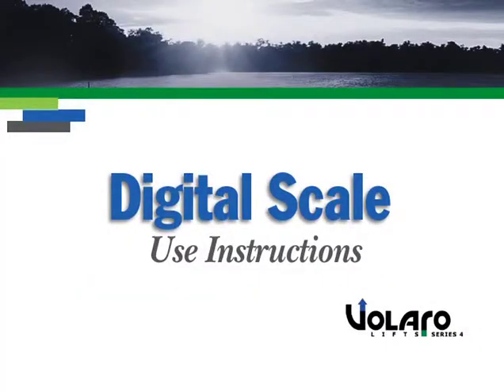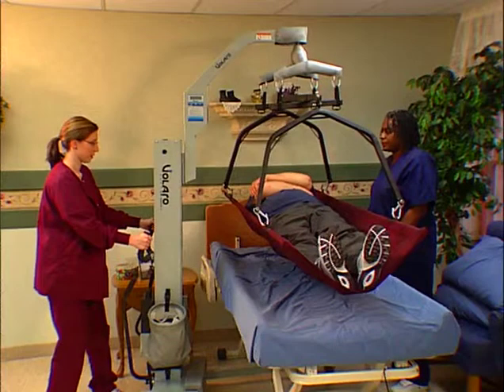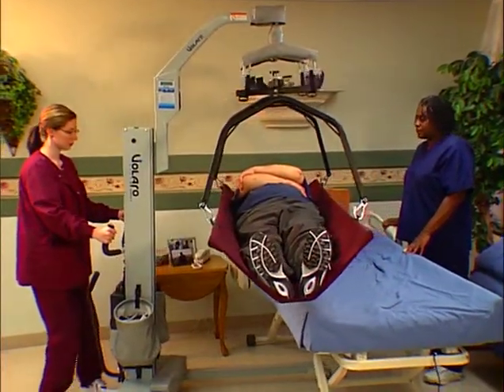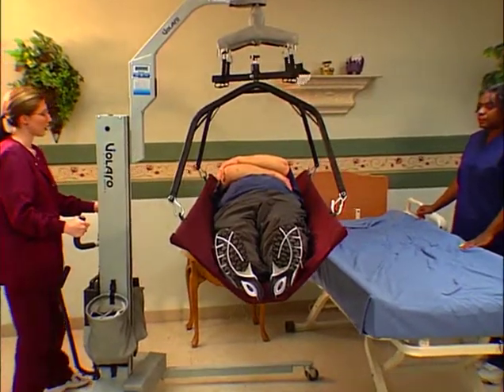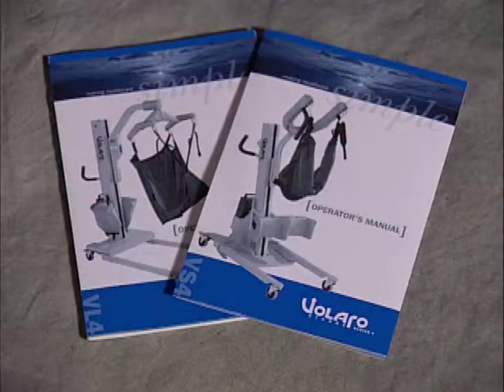If you are using a Velaro lift with a digital scale option, you will have the added convenience of being able to accurately weigh your patients while they are in the lift. In addition to the following digital scale instructions, you may also refer to the guide located on the lift or instructions in the operator's manual.